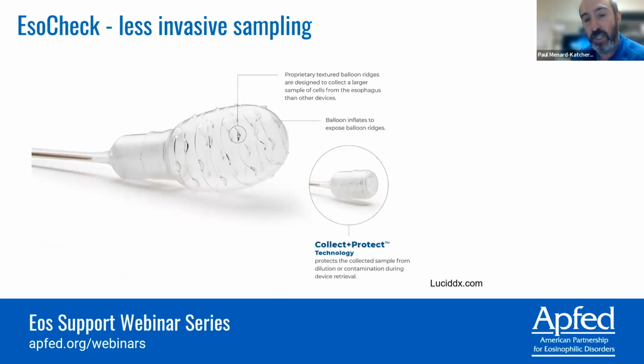Advantages to the EsoCheck are that, again, it can be used in the office setting, is very quick, less than 10 minutes, and can be sent to pathology. This has only been evaluated in Barrett's esophagus and has not yet been evaluated in eosinophilic esophagitis or in children. So with that, I'll stop sharing my screen and we'll move on and learn from Dr.